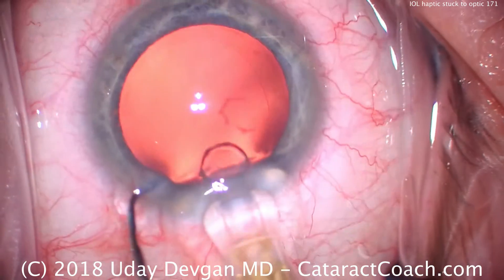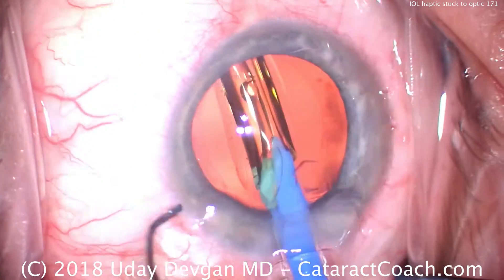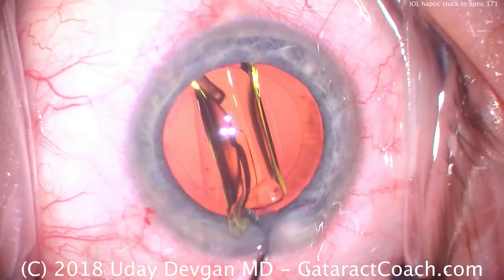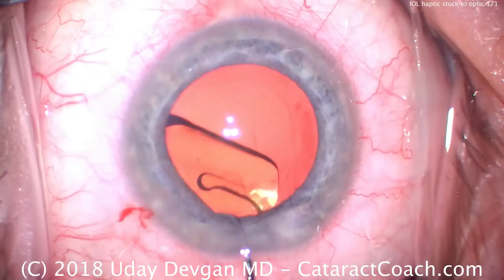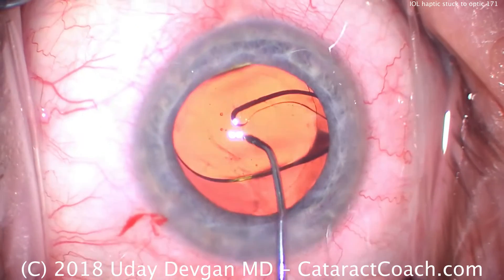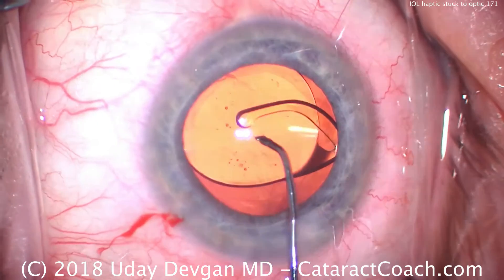And here comes the lens — fixating the eye, there it is, delivered. Goes in the eye quite nicely. The lens is beautifully folded; everything looks great. The leading haptic is already unfolding. The trailing haptic is not unfolding yet, so we'll rotate the lens and give it some time. I try to swing it back and forth, but you've got to be careful here — you don't want to put too much stress on the capsular bag. It's still not doing anything.